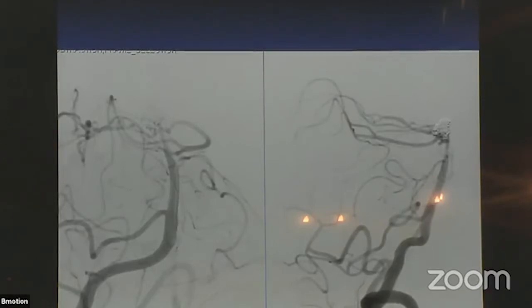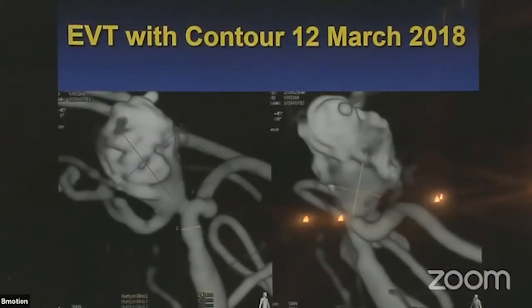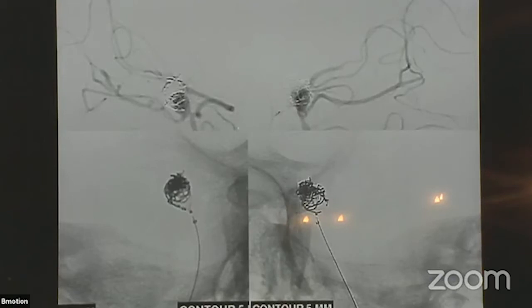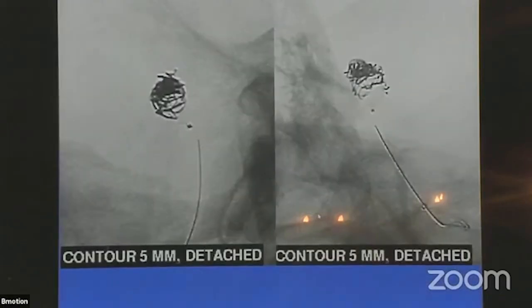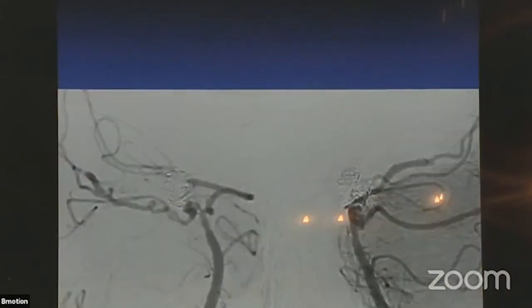This is the follow-up image from January, and this is the 3D reconstructed image showing the measurement. The vessels are very narrow. The device is placed at the neck — here is the assembly point and the detachment point. Once detached, the pusher wire moves away. This is the final angiogram and the 6-month follow-up. The aneurysm is much smaller — the remnant is much smaller. Considering the patient will be on lifelong clopidogrel, I'm happy with this result and quite sure it will not grow.